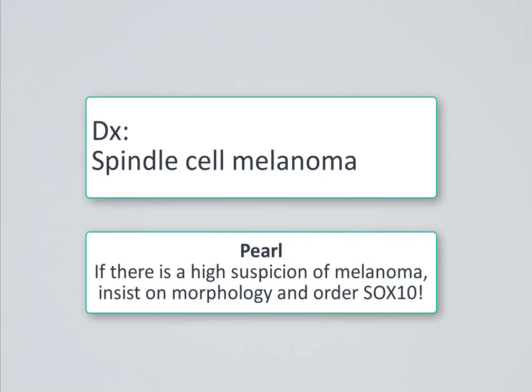So just to remind us, some melanomas can be S100 negative, especially in the mucosal areas, in the rectum and here in the head and neck region. And if you highly suspect melanoma, you have to order S100 and SOX10 together.